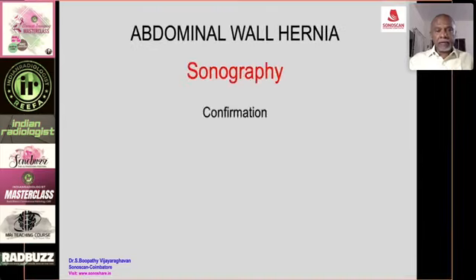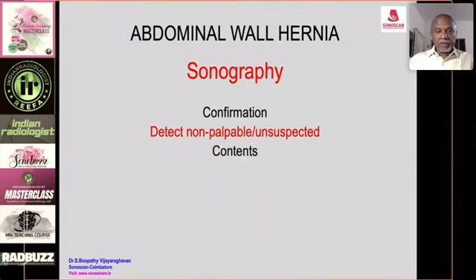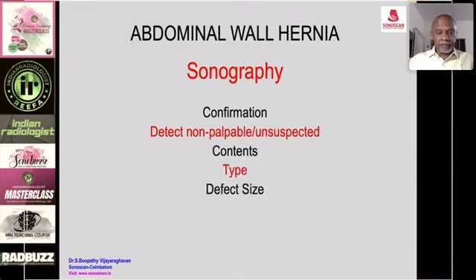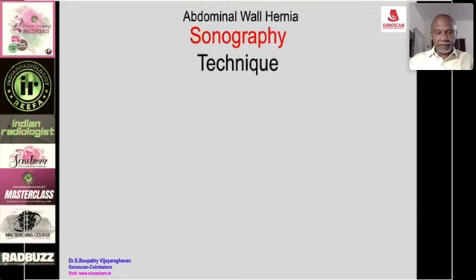The role of ultrasound is in confirmation of the hernia, to detect a non-palpable or an unsuspected hernia, and to know the contents, the type of hernia, the defect size for determining the size of the prosthesis, associated conditions and complications, and the post-operative follow-up. So, I will cover this lecture under these headings.